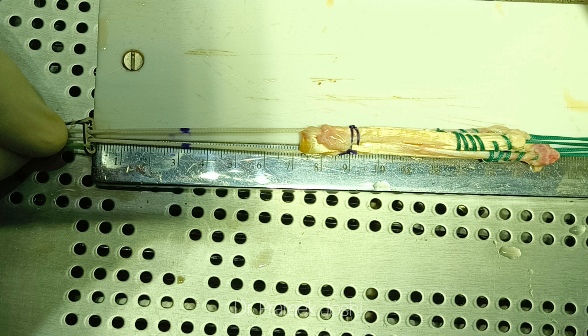The diameter of the graft at both ends is 9 millimeters and we have passed the graft through the loop of the adjustable loop endo button. We have made a marking with the marker pen at the 35 millimeter mark on the loop because the length of our tunnel is 35 millimeters. The vicryl on the graft corresponds to the 20 millimeter mark, which is the length of the graft that we want to be in the femoral tunnel.